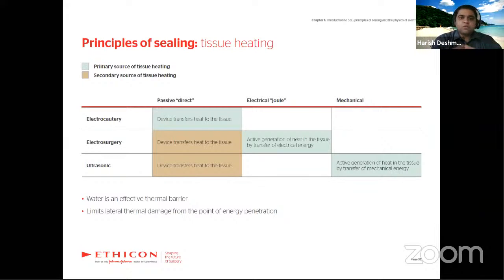That is called electrocautery. In general terms, we say electrocautery for all our electrosurgery units, but we should say only electrosurgery, or monopolar or bipolar device. Because electrocautery in physics terms is heating a metal and then using that heated metal for coagulation.